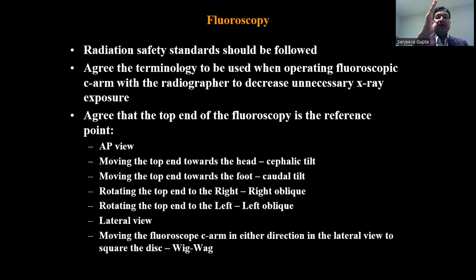Moving the top end towards the head is called cephalic tilt, and moving the top end towards the foot is called caudal tilt. Moving the C-arm to the right is right oblique rotation, and then left oblique rotation. And the lateral view is, of course, this way, when the C-arm is surrounding the patient.